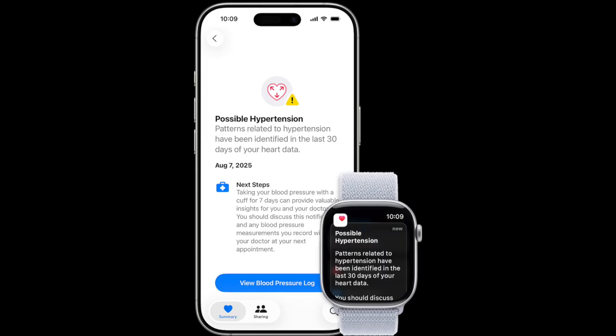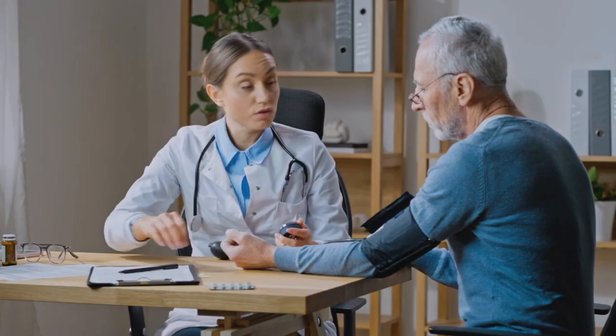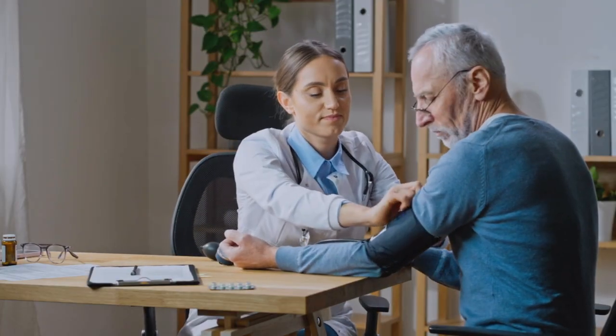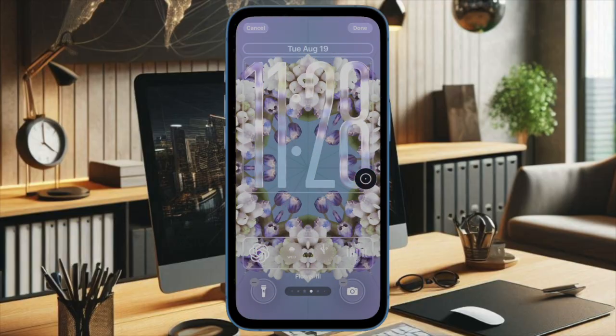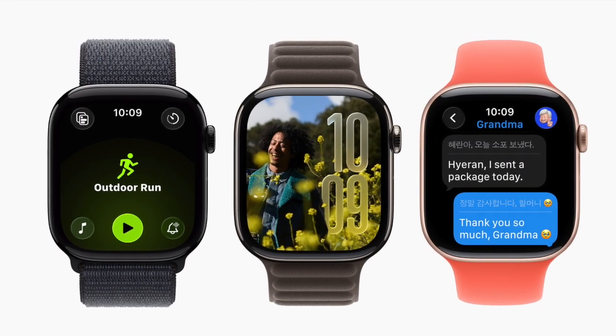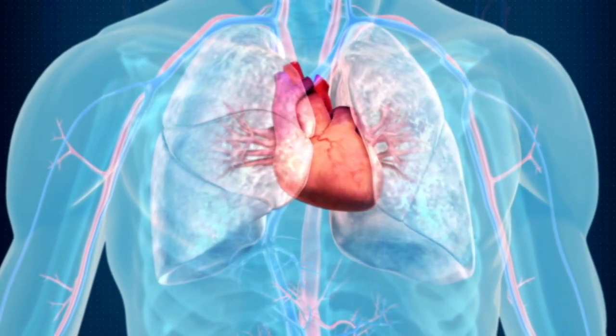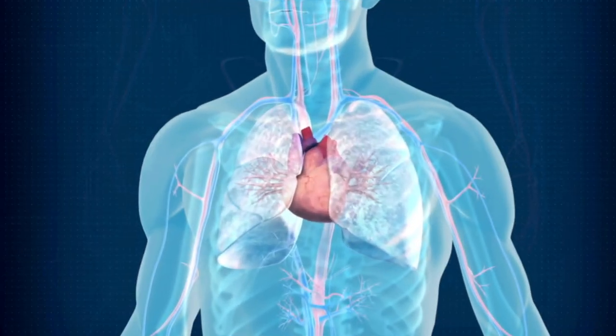Now, what do hypertension notifications actually do on Apple Watch? They monitor irregular heart rhythm patterns to detect potential signs of high blood pressure. When enabled, you receive alerts on both your Apple Watch and iPhone if your device identifies cardiovascular activity that may require medical attention. Your Apple Watch continuously monitors your heart rhythm in the background, and if it detects patterns that may indicate hypertension, you will receive an instant alert with findings and guidance to consult your healthcare provider.